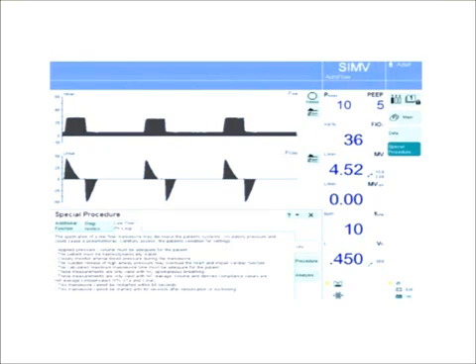Now the operator can set the P-high based on the pressure-volume curve from a static measurement. They can base their P-high measurement on looking at a value in the PV curve and looking at the lower inflection point and the upper inflection point.